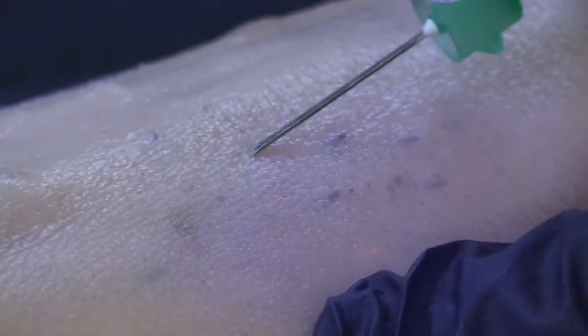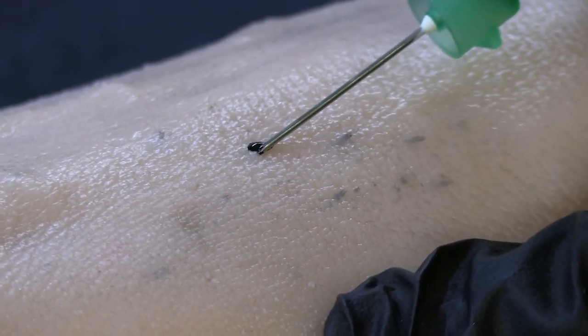The UV pink tattoo mark can only be seen under UV lighting. The vaccination method can also be applied with black ink.